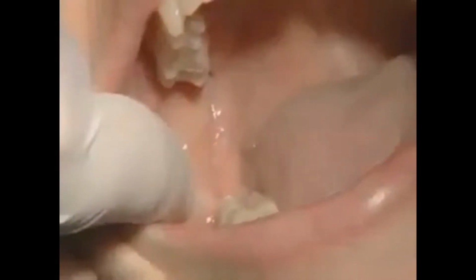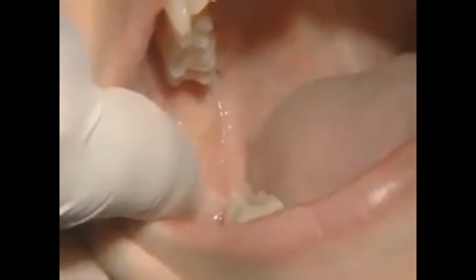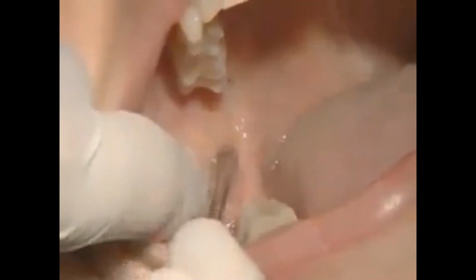Then by retracting your finger out laterally again and resting on the external oblique ridge, you expose the pterygotemporal depression, which is this depression shown at the end of the probe here. It is within this depression that the needle will be inserted.